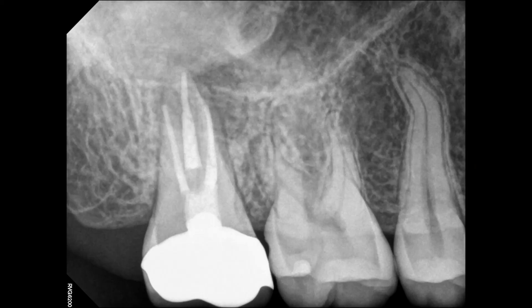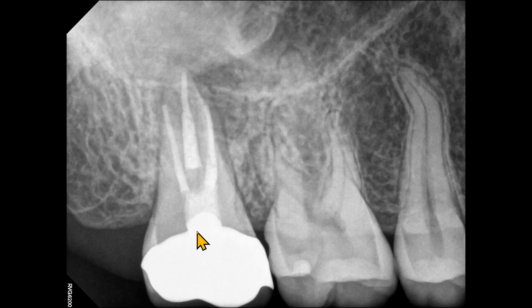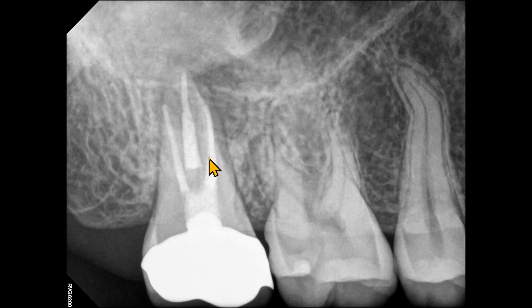This is the first radiograph. We have one periapical radiograph of the maxillary right posterior region. The third molar is missing. The second molar is endodontically treated. The radiographic findings suggest adequate obturation of all three canals. Based on this radiograph, we do not know if there is an MB2 canal. At the cervical area of the palatal root, we do not see any radiopaque obturation material.